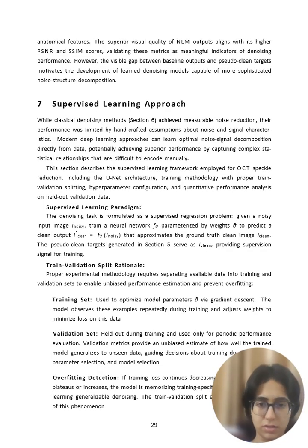So we need to consider and answer these limitations. What we are using now is a supervised learning approach. We have already created target pseudo clean images that are our reference for what our image should be and what our image actually is right now. Supervised learning is basically when we know what we should have had and our prediction, and we keep improving our predictions on the basis of the reference. When we have the reference, we call the learning approach supervised. When we do not have any reference to look at, the learning approach is known as unsupervised. And the third type is reinforcement learning, when we keep making mistakes and learning. So basically we are using a supervised learning approach in this.